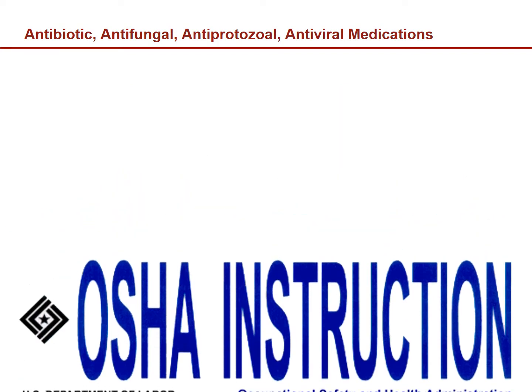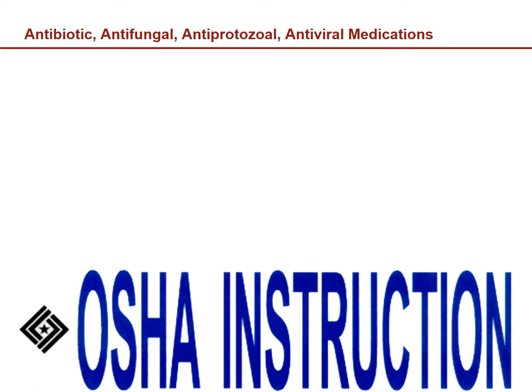The U.S. Department of Labor Occupational Safety and Health Administration has specific instructions for protecting oneself when administering antibiotic, antifungal, antiprotozoal, or antiviral medications. Although the risk of secondary exposure is low, unintentional inhalation of fugitive aerosols can occur when the nebulizer mouthpiece or mask does not properly fit, or when separated from the patient's mouth. For example, when the patient is coughing.